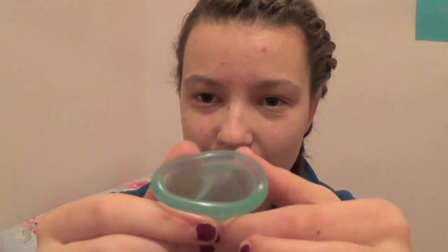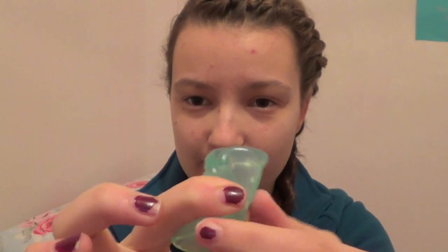I either use the punch down fold, which is where you take your finger, punch the cup down inside itself, and that gives you this kind of shape. Also, one of my favourite folds to use is the 7 fold, where you take the cup, fold it in half like that, and then just pull a corner down, and it makes a 7 shape. I hope that's not backwards on here. Okay, so just for this, I'm going to use the punch down fold.